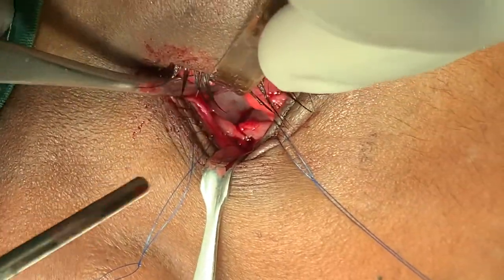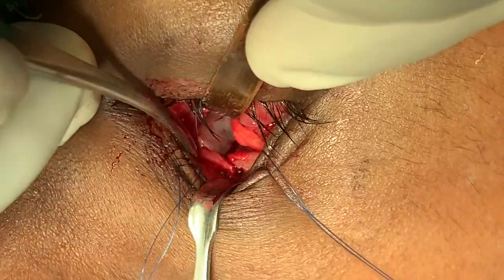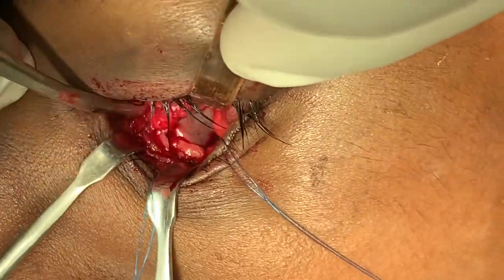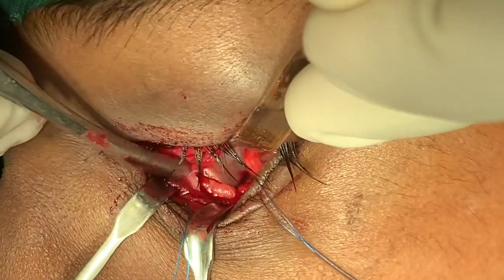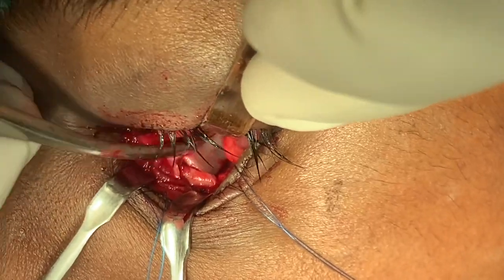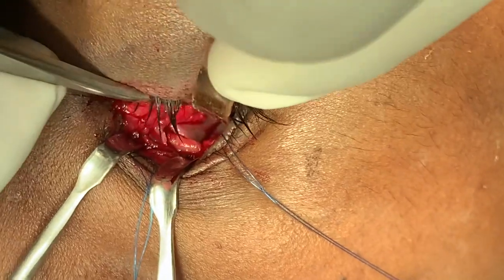So it's like a nice window fracture with the orbital rim fracture. So this is an impure blowout. So in these kind of cases, what I like to do is, you see that? There's one fracture here. I hope you can see it. Yeah, that's nicely seen now. So one fracture here, another fracture there. This is a center segment that's moved down. Now these kind of fractures, you definitely have to reduce and reconstruct, so to say.